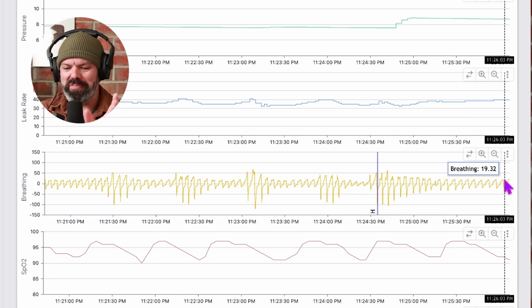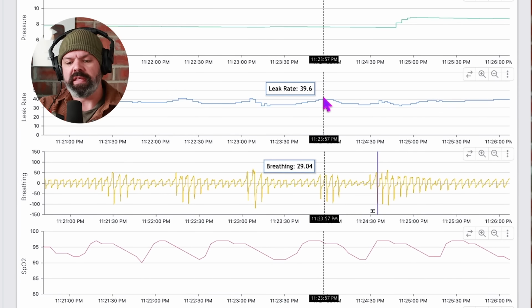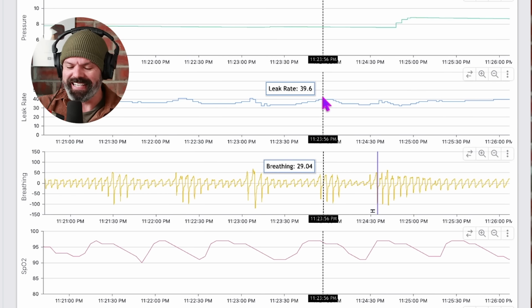Okay, so this is why I said previously that the AHI is an underestimation, and we see this all the time. I've done heaps of videos on it. I often get asked, if the AHI is really low, do leak rates even matter? Does it matter if they're kicking up here at 40 litres per minute? And this is why the answer is always yes, they do.